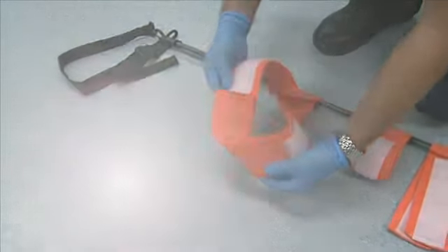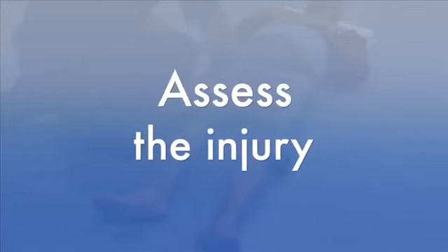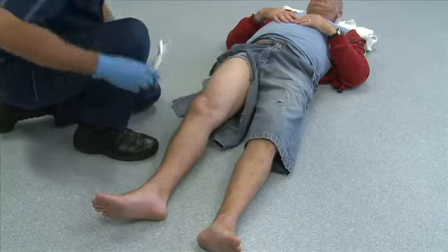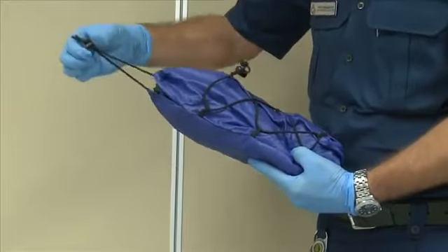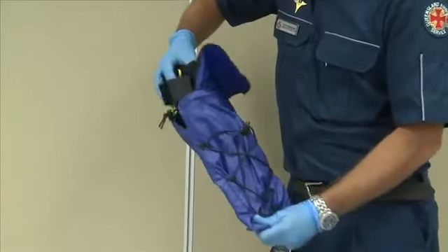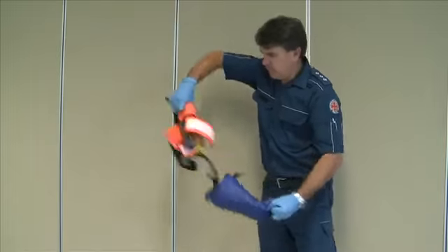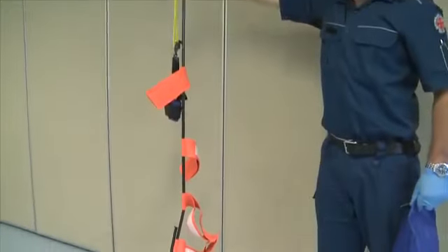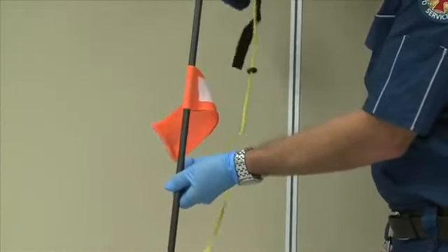We will now demonstrate the use of the CT6 traction leg splint. Step 1: Assess the injury, expose the affected limb and assess the limb for distal perfusion. Step 2: Remove the splint from the bag — release the external bag straps and remove the splint. Step 3 Assembly: As the splint is removed from the bag, hold it at shoulder height and shake it up and down, allowing the tubes to hang and intersect. Now manually connect any unlinked sections.